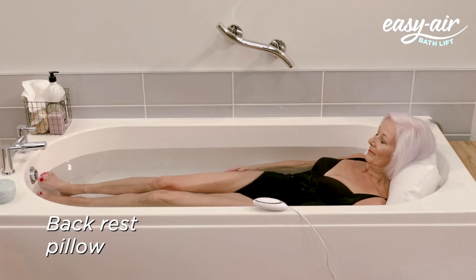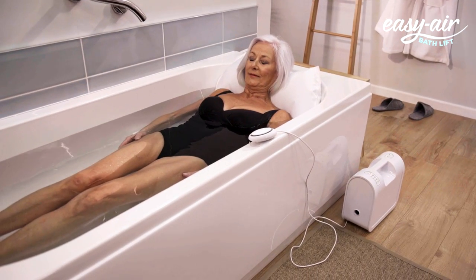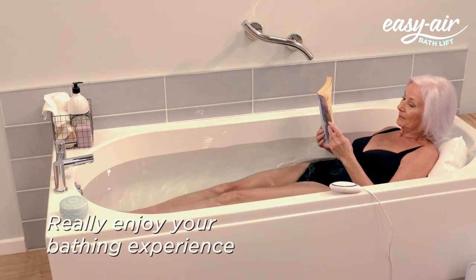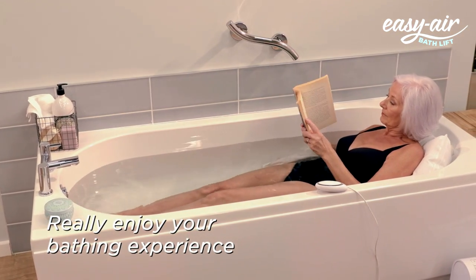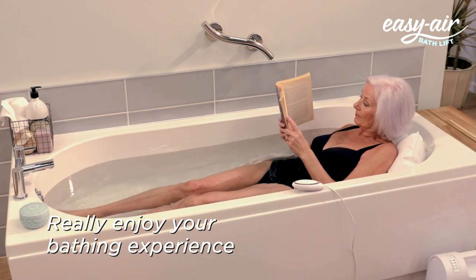Designed with minimal seams, the Easy Air Bath Lift is comfortable against your skin. Let any stresses, aches or pains melt away and really enjoy your bathing experience. With the Easy Air Bath Lift, you can relax in a fully reclined bath without the worry of how to get out.